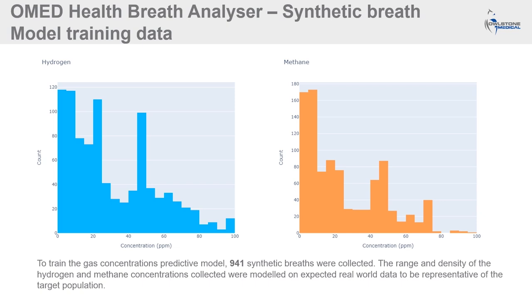Thanks, Josh. Hi, everyone. I'm Riccardo, and I'm a senior data scientist here at Owlstone. My team and I are the ones who developed the machine learning algorithm that sits at the heart of the OMED device and interprets multiple sensor readings to return the concentration of hydrogen and methane on breath. To gather enough data to train the algorithm, we use the synthetic breath rig to generate a high amount of synthetic exhalations, which we call exposures, at different combinations of hydrogen and methane concentrations, at different temperatures and different humidities.